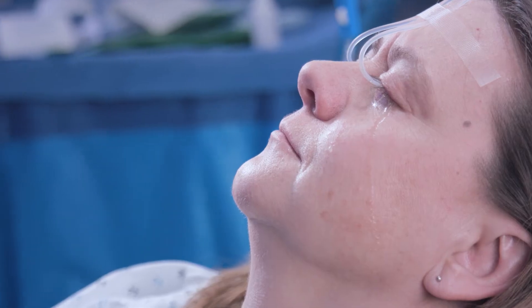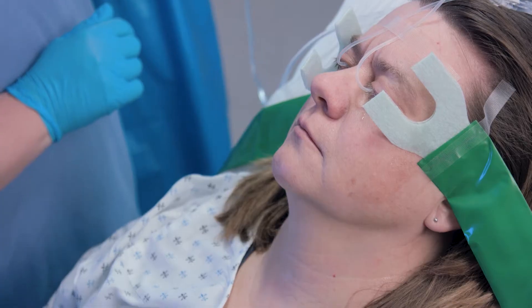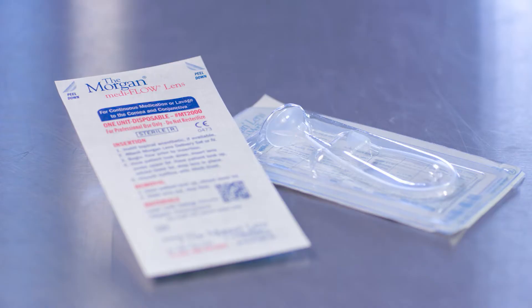When treating severe infections, doctors have used the Morgan lens for continuous eye irrigation for 7 to 10 days or more, removing them only long enough to examine the eyes.